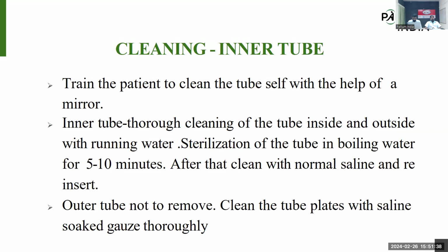After cleaning, for sterilization, we can boil it for 5 to 10 minutes in boiling water. After that, they can clean with normal saline. Then they can insert it, with zero droplets inside the tube after the cleaning. We need to ensure that only after complete drying can they reinsert the inner tube into the outer tube.